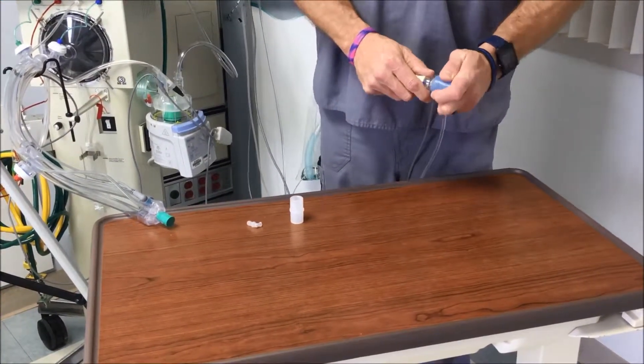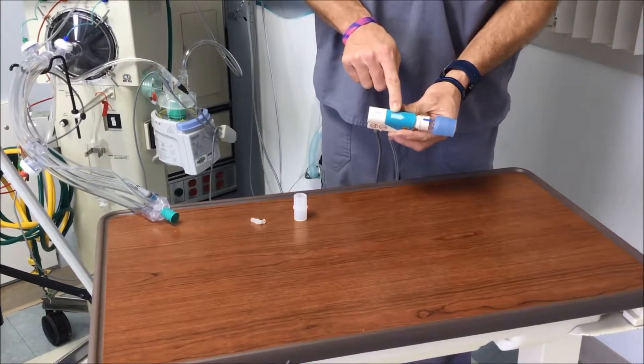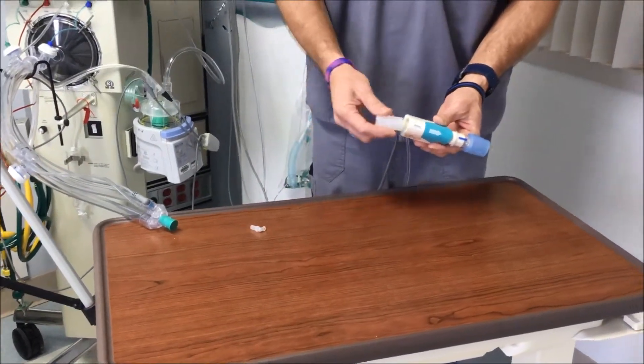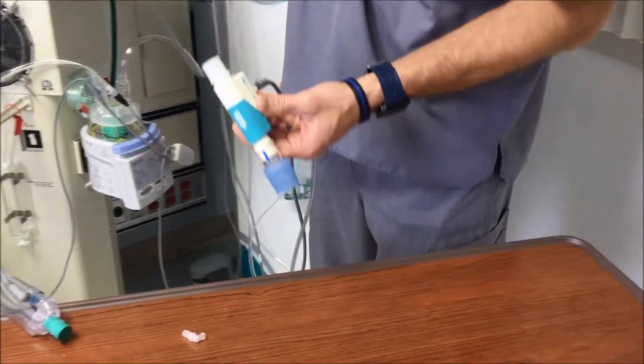The 22 millimeter adapter connects onto the one-way valve. The arrows on the injector module correlate with the arrow from your one-way valve. The 15 by 22 millimeter adapter then connects on the back of the injector module.